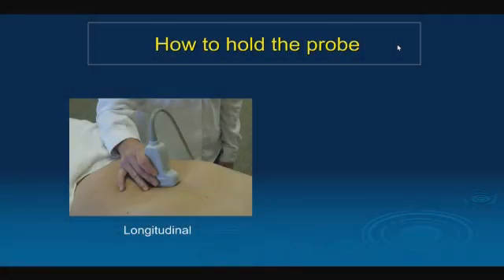All right, so we're going to get down to the nitty-gritty here with our scanning fundamentals. Many of you have already been scanning in some type of ultrasound, but some of you, this might be your first introduction to scanning, and so we want to make sure that we don't leave anybody out. The first thing is, how do I hold the probe or the scan head? The first thing is, you cannot be afraid to get yourself all gelled up, because you're going to have gel all over you, up to the armpits.